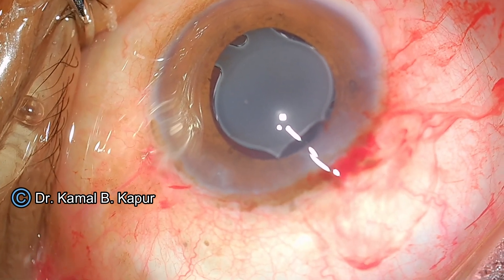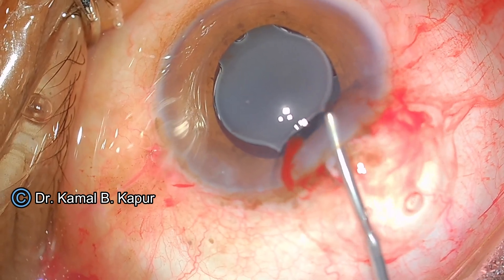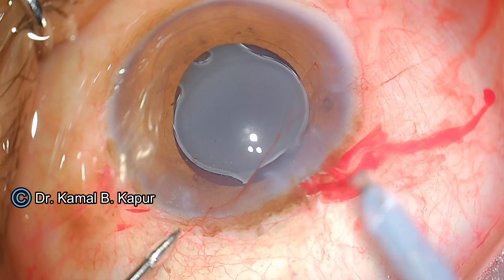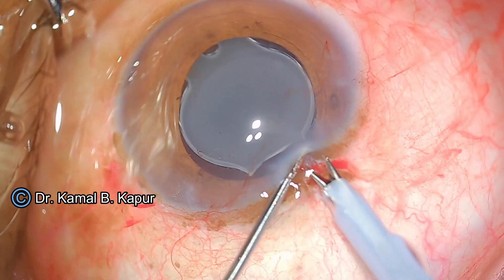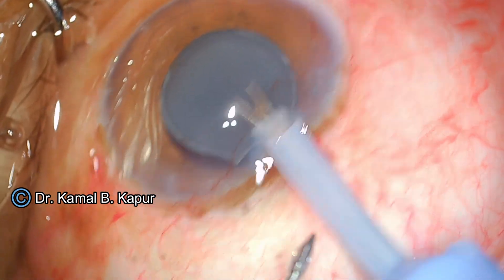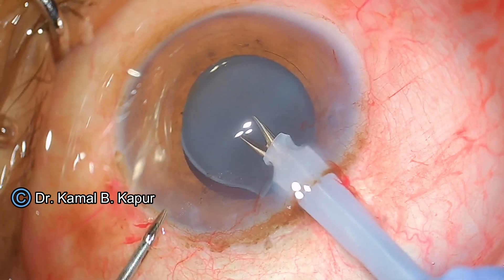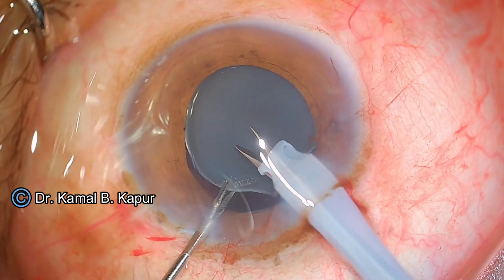Enlarging the wound will ease the insertion of the phaco tip cutter with the sleeve, and since I have to extract the cut lens pieces I will probably need a slightly larger wound. So I enlarge the wound to approximately 3.5 millimeters. Now notice my left hand — it will go and grasp the IOL while the cutter engages the IOL surface.